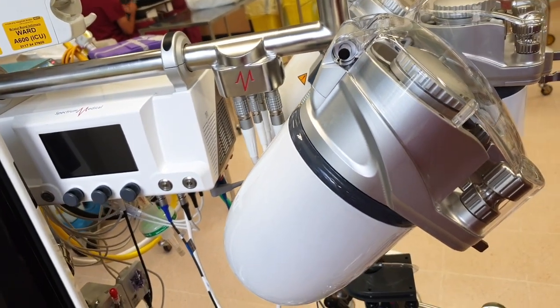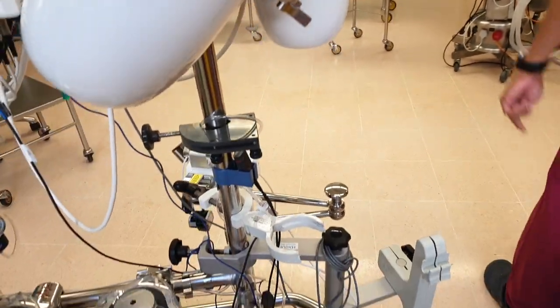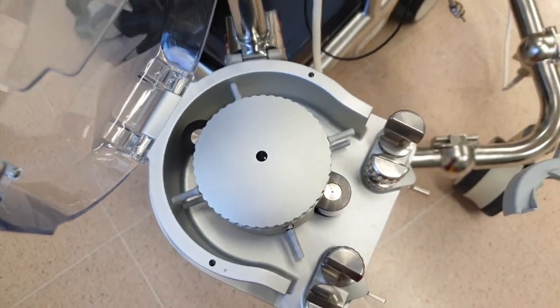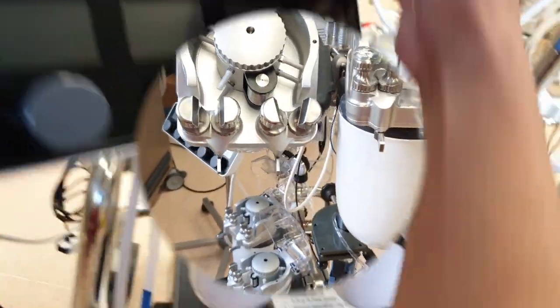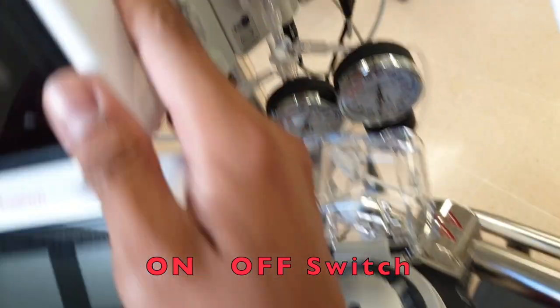This is the sucker and the vent module. And this is the dual pump for cardioplegia. And this is the main arterial pump. It looks really, really fresh. So the first step is turn this on, the switch here on this side.